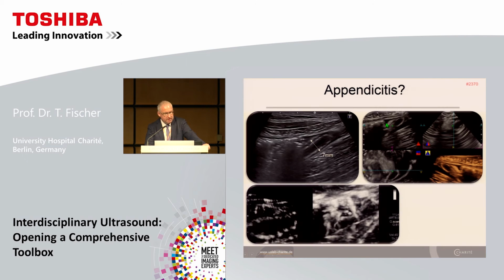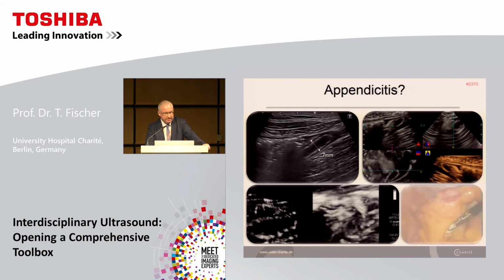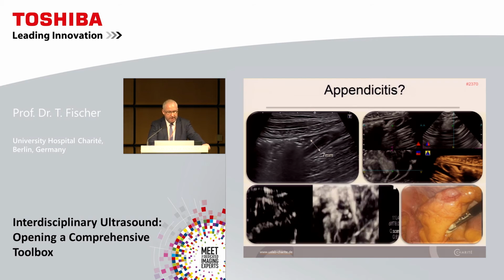Then switch back into SMI and reconstruct this 3-dimensionally. We see beautifully, once again, the entering of the vascular architecture here in this inflammatory disease, and this is how it looks in reality. So perfect matching here between SMI and the reality.